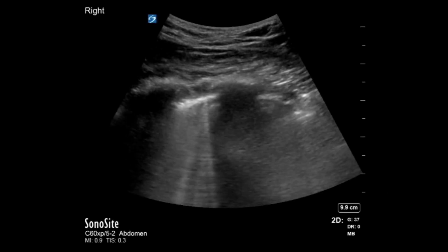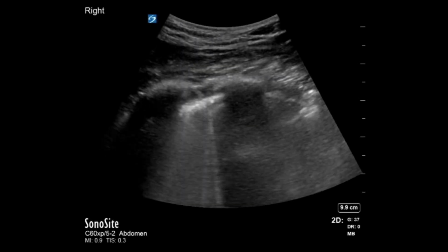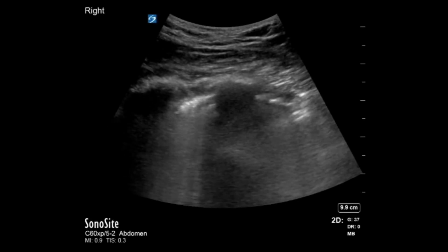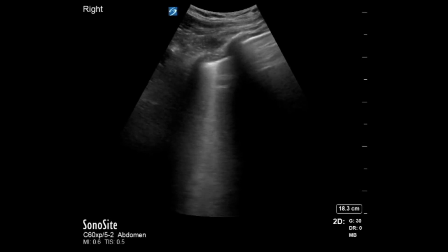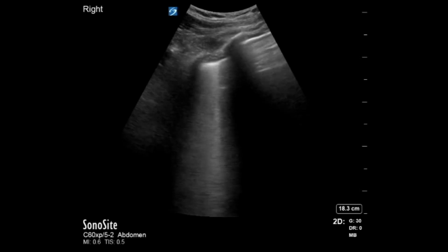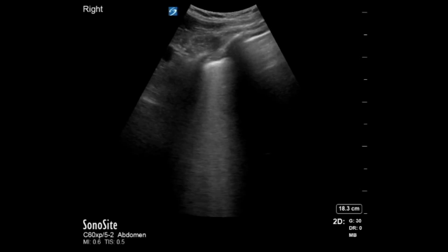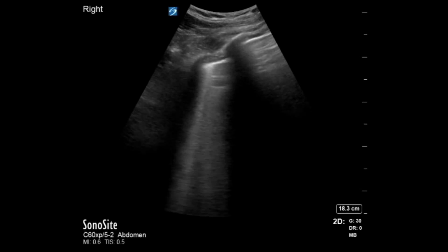But because you use ultrasound in your medical practice as well, you astutely identify B-lines at his right base. These confluent bright lines extending from the pleural surface can also be seen at a greater depth of field and signify interstitial edema, something that you normally see in your pulmonary edema patients, but are focal to the right base in this trauma patient. Not only have we excluded pneumothorax in this patient, but we've identified the cause for his hypoxia. We've identified his right pulmonary contusion.